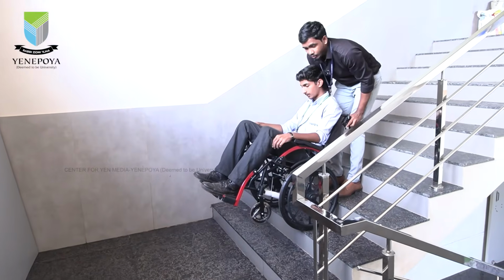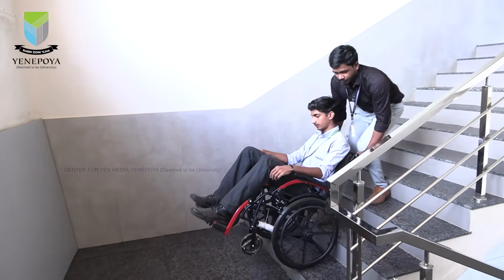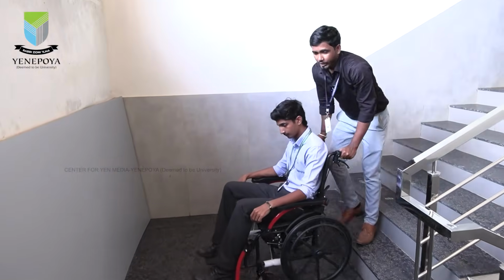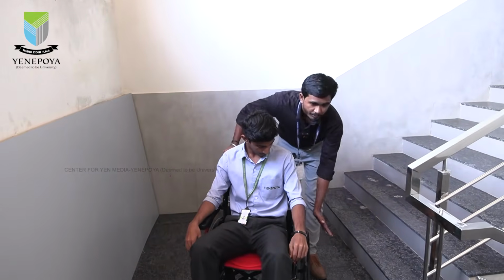Okay, it goes the same way with downstairs also. First I will put down a little bit slowly, then again a little bit forward. While we are doing this, we need the help of this paraplegic patient also, so that they will control this wheelie with the rim.